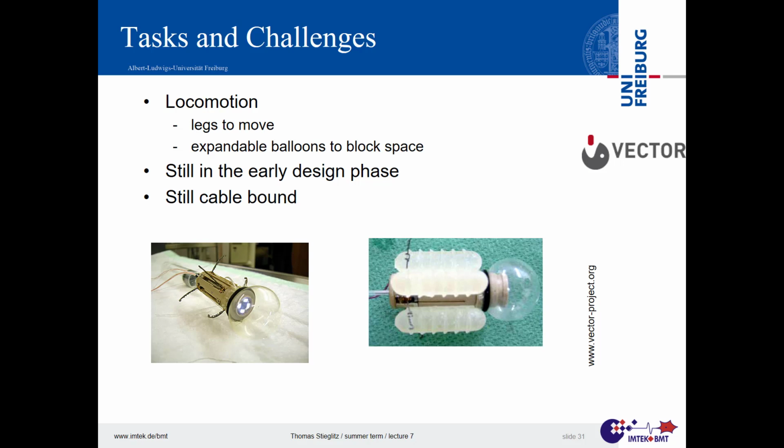The other approach that has gone very far is the worm-like approach, where you have some cushions that can be filled with something, either with air or with fluid, that get smaller and larger, and you have then kind of an inchworm motion that you can propel with. There are also approaches where you have a propeller, like a submarine.